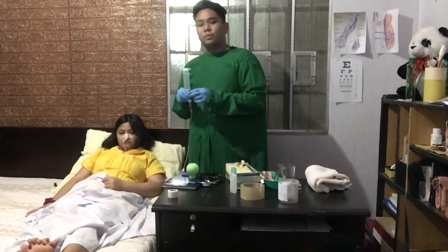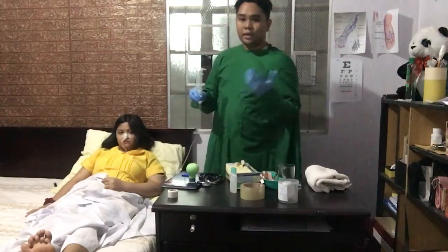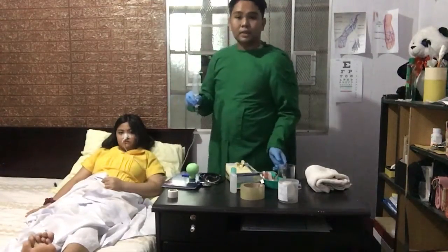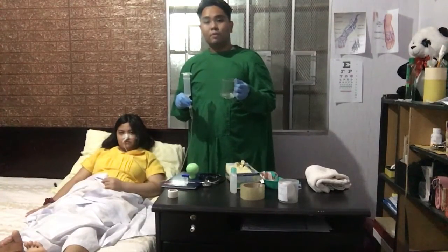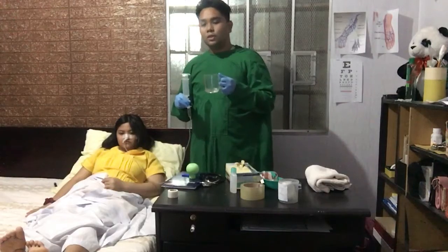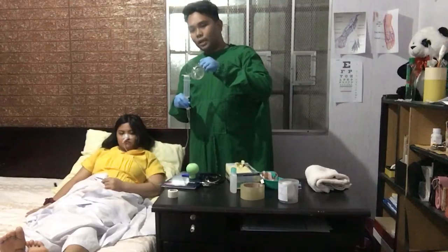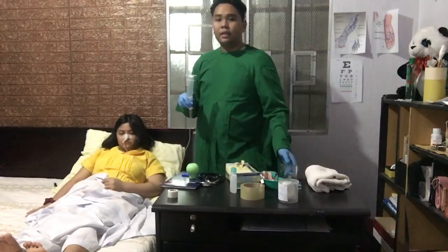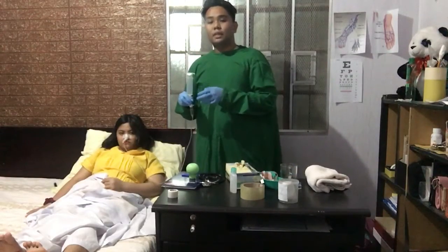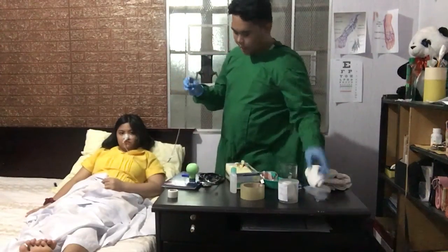Then, we must not push the formula with the syringe plunger. Then, add 30 to 60 ml or 1 to 2 ounces of water for irrigation to the syringe when feeding is almost completed, and allow it to run through the tube. It helps for better passage of the nutrients that we administer to our patient. Then, when the syringe has emptied, hold the syringe high and disconnect it from the tube. Then, we clamp it.